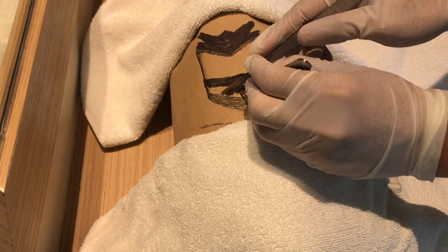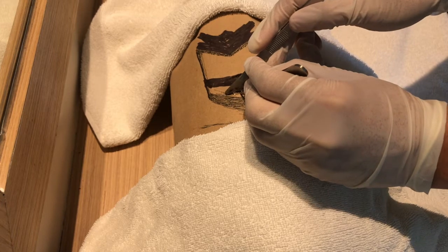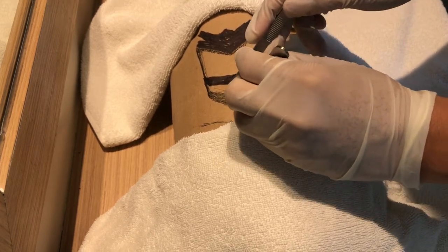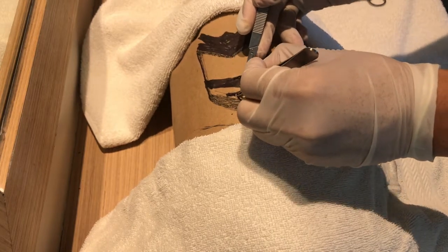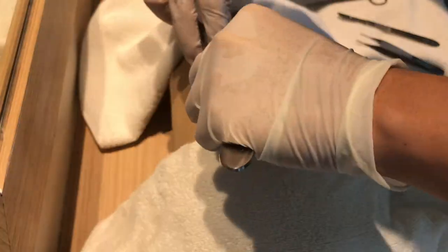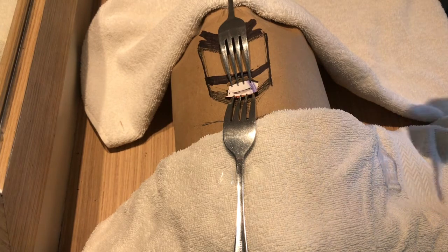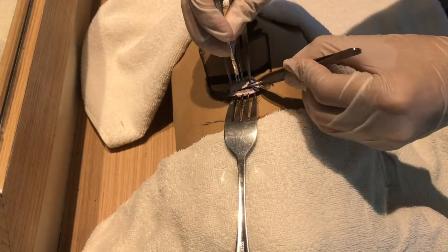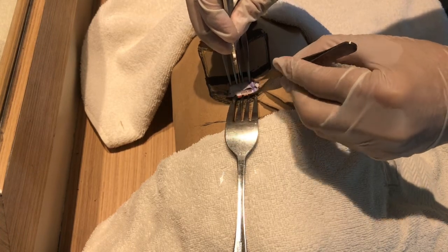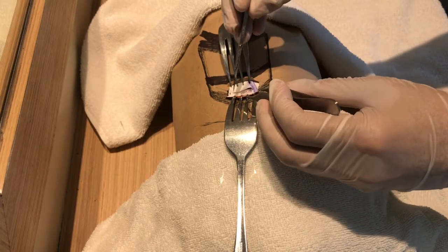Then, make an incision in the subcutaneous tissue, followed by the platysma and the fascia. Be careful to avoid transecting the anterior jugular veins located superficially to the strap muscles. Divide the intermuscular plane by spreading the pair of scissors. Then, separate the sternothyroid muscles and retract the muscles laterally.